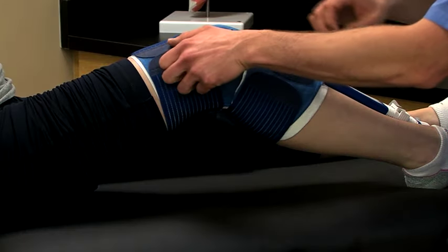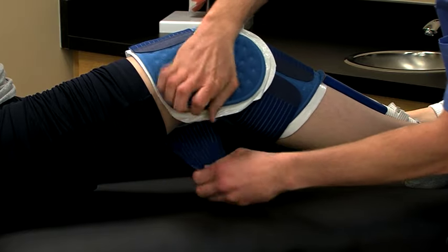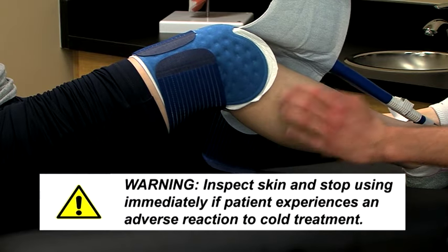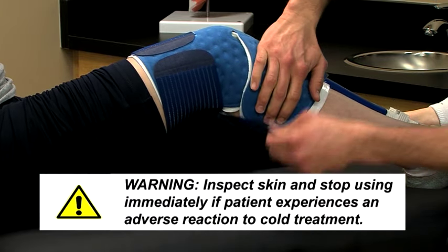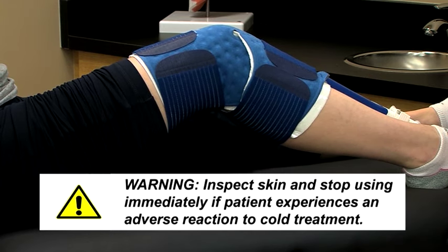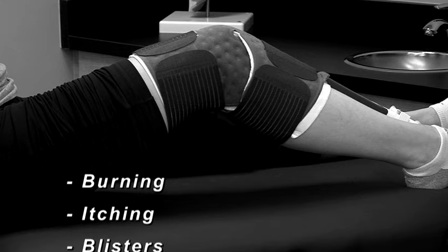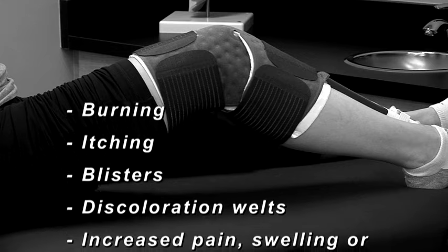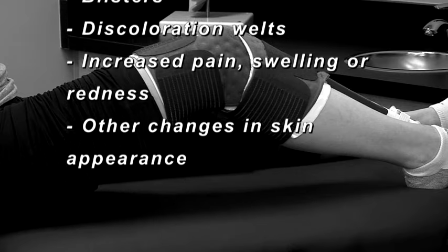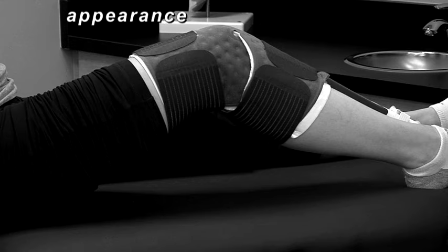Be sure to inspect the patient's skin under the pad as prescribed, typically every one to two hours. You should be able to inspect the skin by lifting the pad and insulation barrier. Discontinue use and contact the physician if your patient experiences any adverse reactions, such as burning, itching, blisters, discoloration, welts, increased pain, swelling or redness, other changes in skin appearance, or any other reactions that have been discussed with the physician.